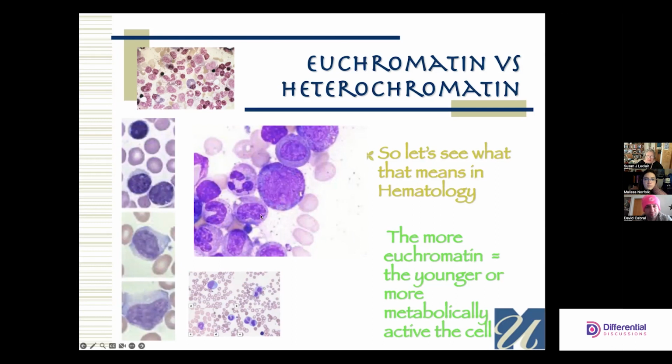And this is a metamyelocyte. Again, yeah, you got small groupings of DNA, but look at how thin that membrane is. And what do you think? Maybe it looks like a checkerboard on acid or some other hallucinogenic. It's kind of twisted, but you get the sense it's about half and half.